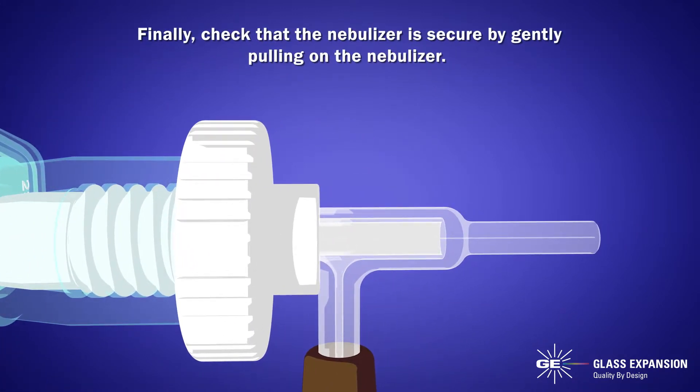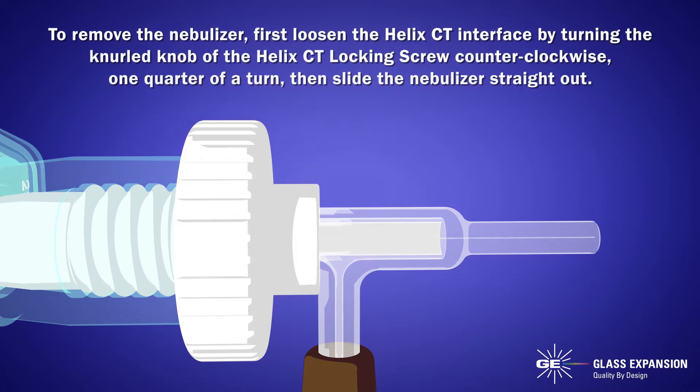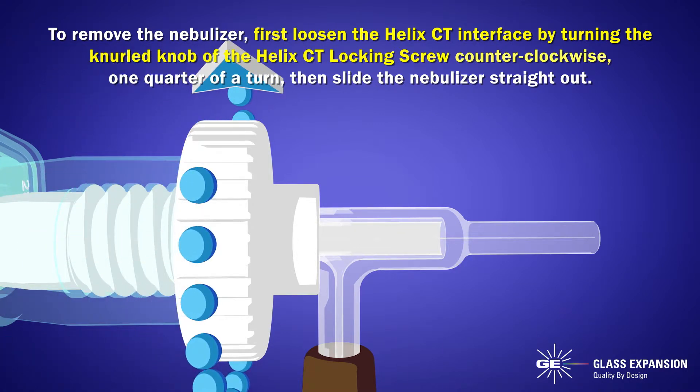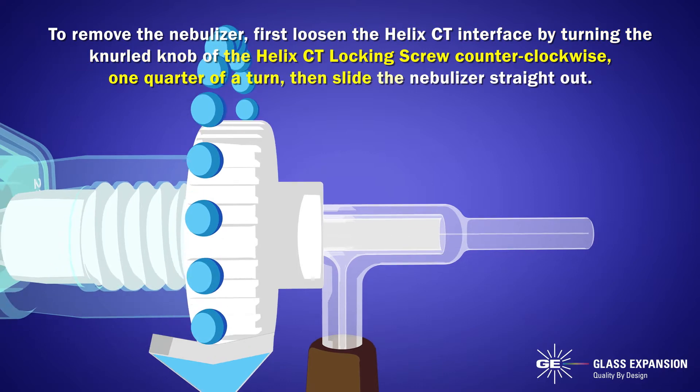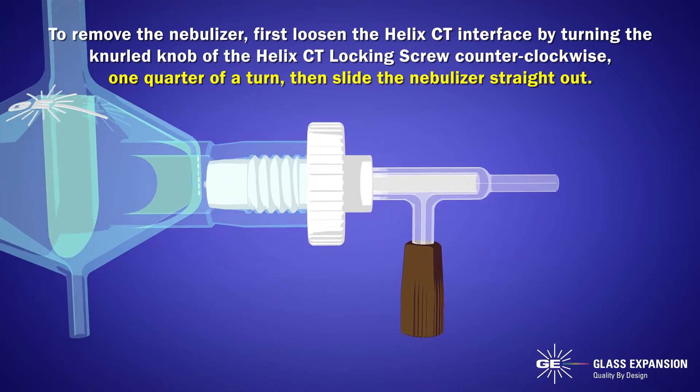Finally, check that the nebulizer is secure by gently pulling on the nebulizer. To remove the nebulizer, first loosen the Helix CT interface by turning the knurled knob of the Helix CT locking screw counterclockwise one quarter of a turn, then slide the nebulizer straight out.